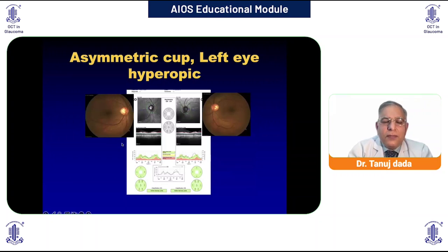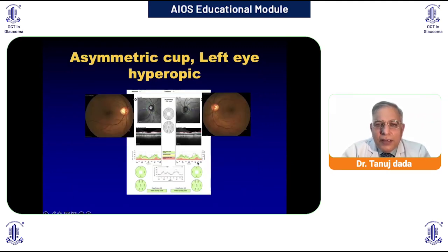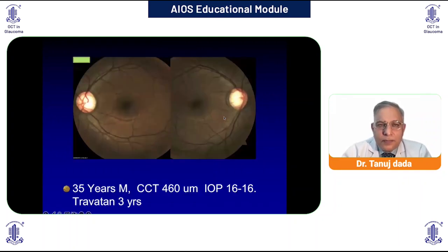And you can see in patients who have an asymmetry in the refractive error, you can have an abnormal size of the disc as compared to the other eye. So this was just an aberration. This is a physiological cupping, more in one eye as compared to the other eye. The OCT was absolutely healthy RNFL. So you can tell the doctor, no need to worry. It's just a physiological variation of the optic nerve head. You don't have any glaucoma.